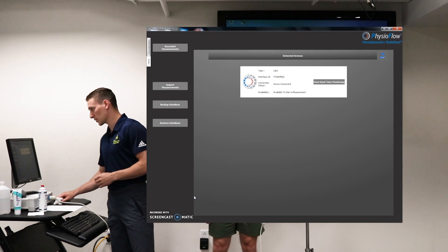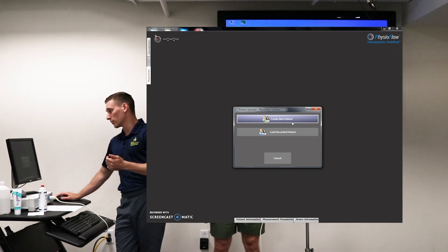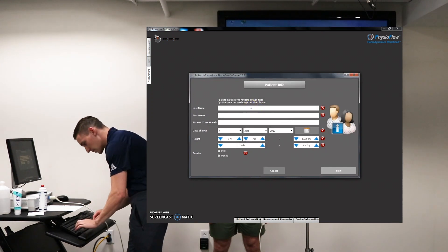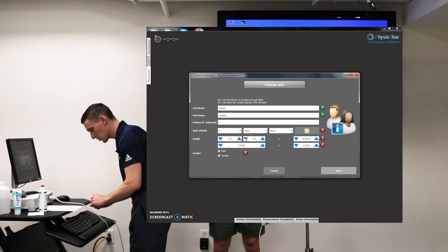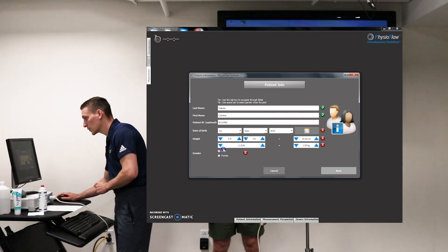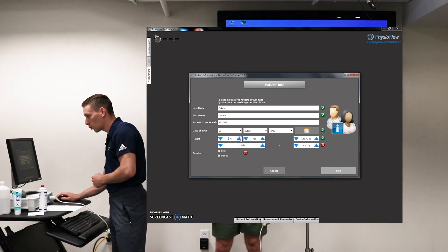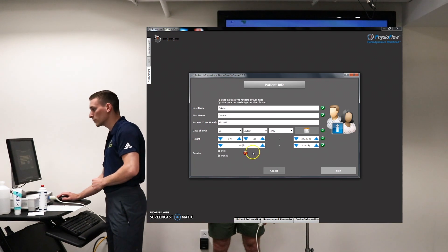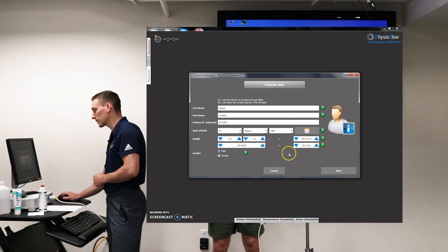Now we can get started with the calibration process — we'll run through and put all of his information in. If the client had been here before, we'd hit 'load recorded patient.' Because he hasn't been here before, we're going to create a new patient. His last name is Dakota, first name Carmine. For his ID we'll use his birthday: 8-21-1996. Our subject is 6 foot 1 and 185 pounds. Go down to the gender, click male, and check to make sure all the information is correct, then hit next.